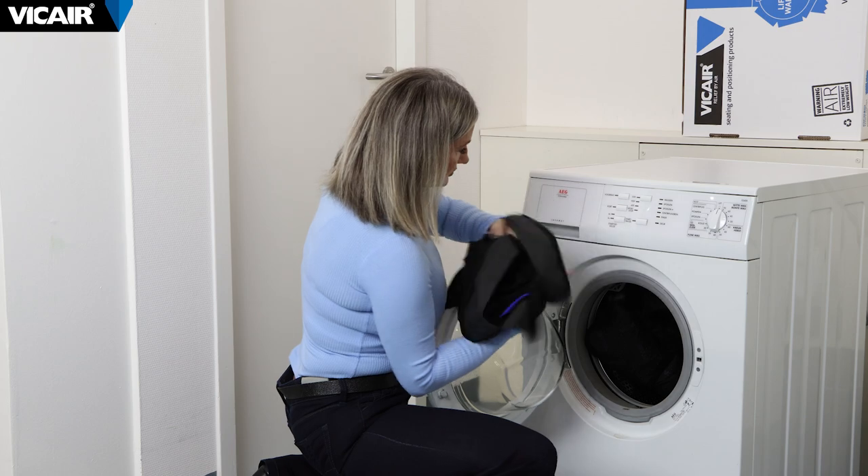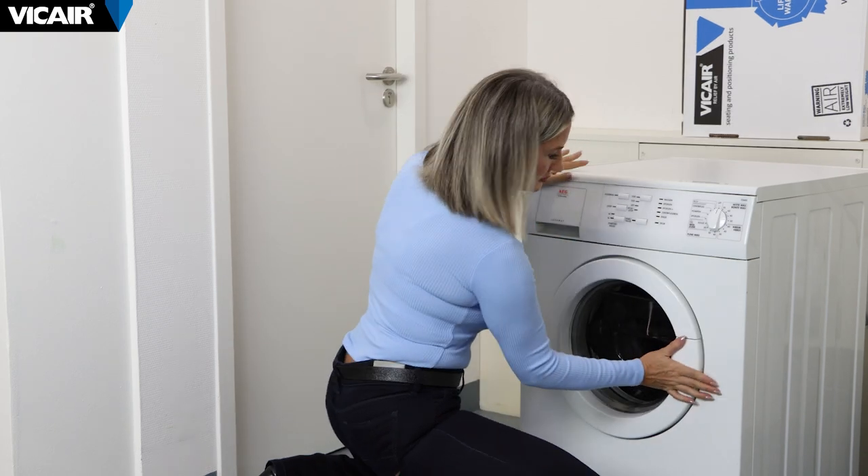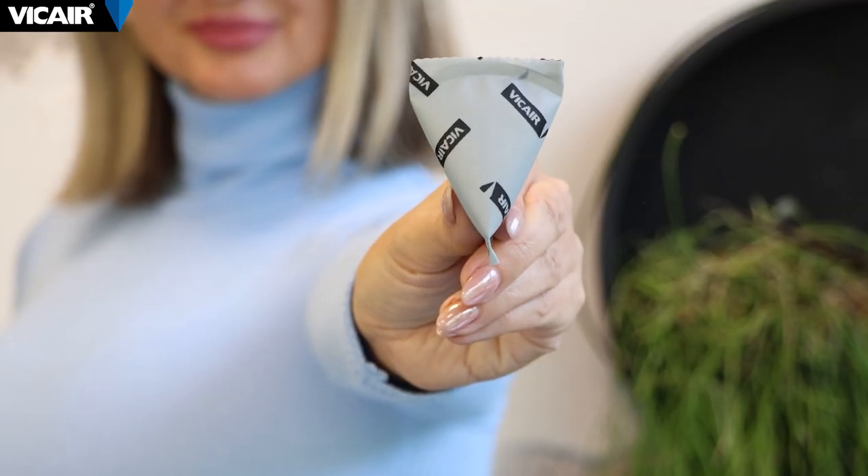Smart cells stay in their compartments, so the setup is maintained. The cushion is safe to use due to hundreds of smart cells inside. Even in the unlikely event that a cell fails, you are still fully protected.